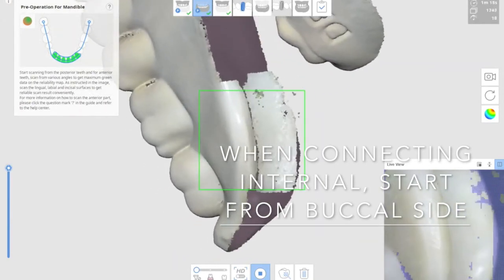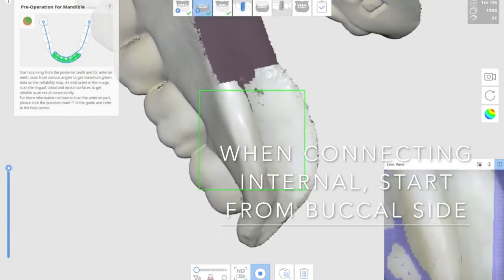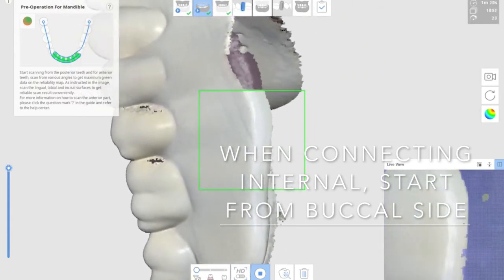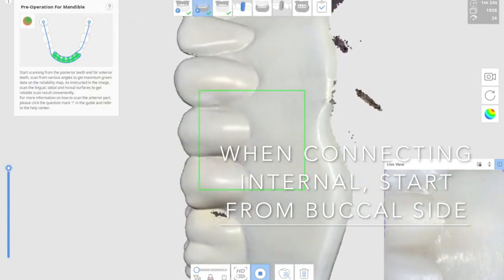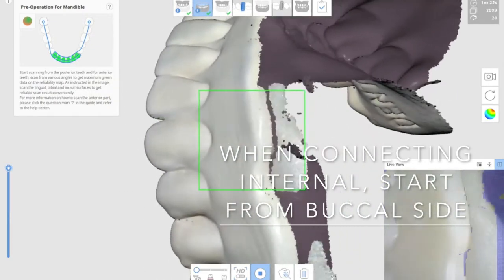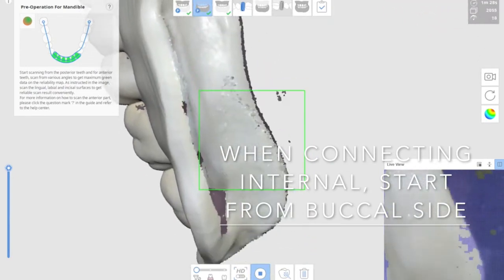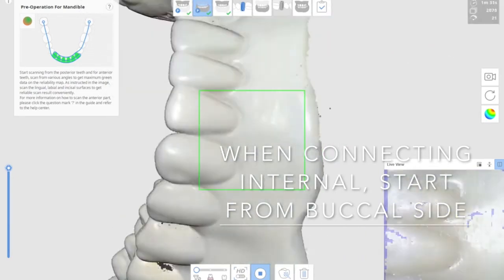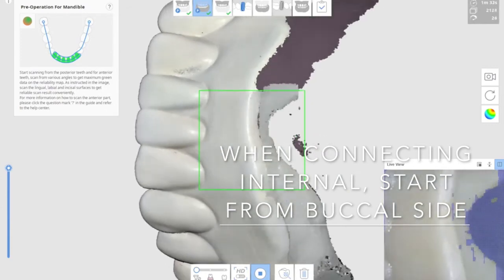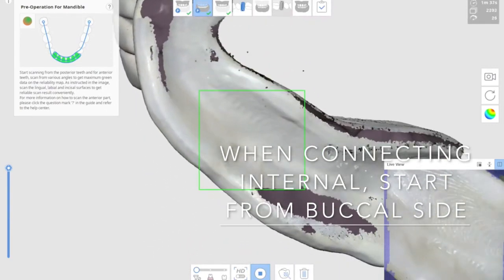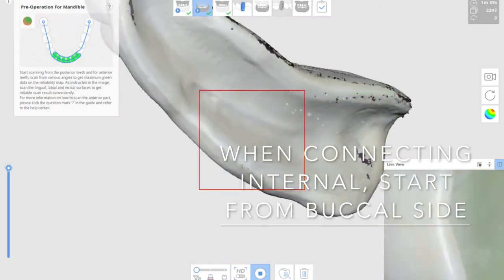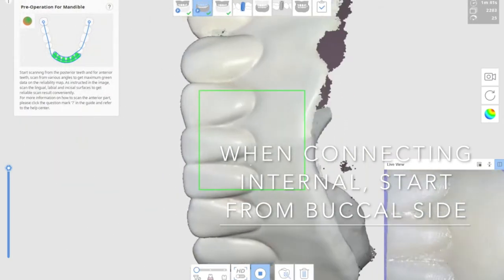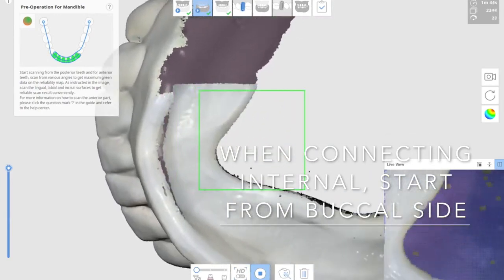Now I'm scanning the internal surface by connecting internal, starting from the buccal side of the try-in denture. You can see that I'm pointing the teeth first, rotating to the border, and then getting into the internal surface to scan. I continue on by moving the teeth scan first and cover the border and the lingual surface. Start from the teeth, rotating it, cover the border, and the scanning internal surface.